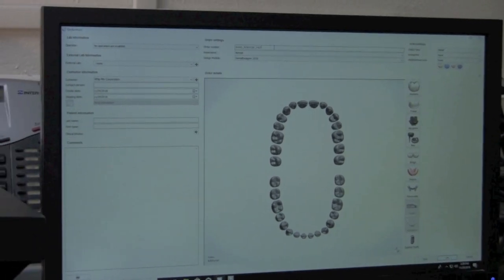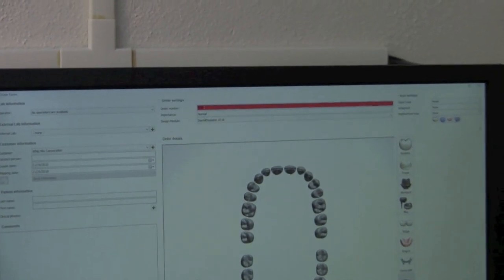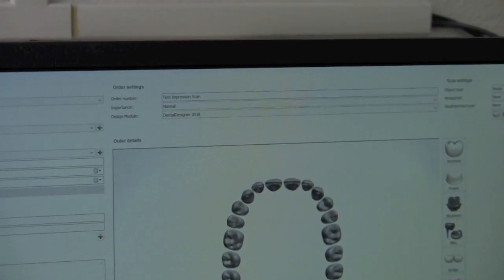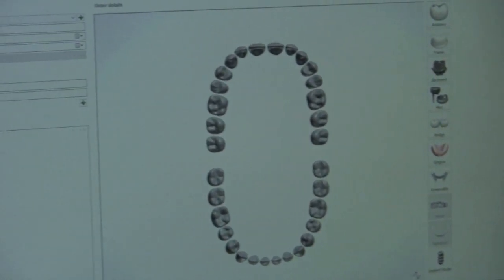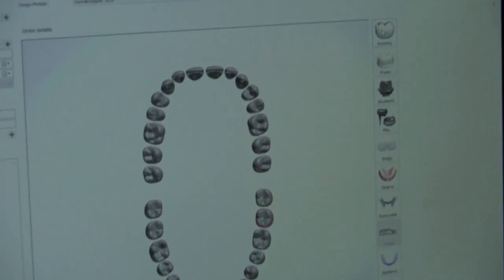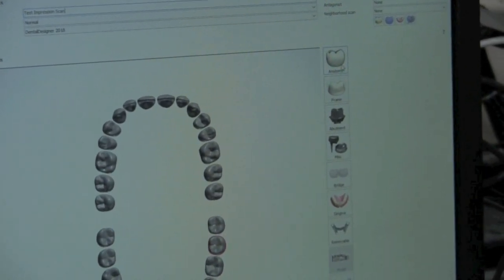The first thing you're going to want to do is set up your case. I'm going to go ahead and just give mine a random name. Now in order to set up for a crown and bridge model you need to select the tooth that you're going to do — this is a number 18 here.